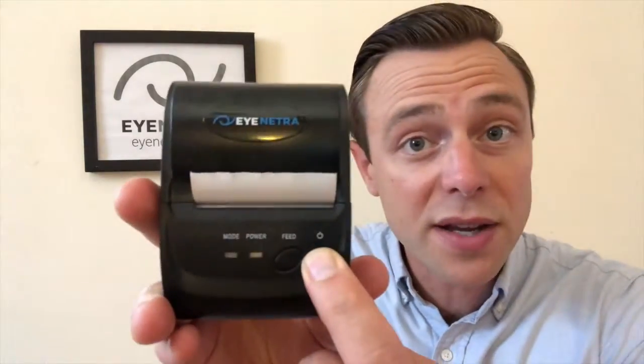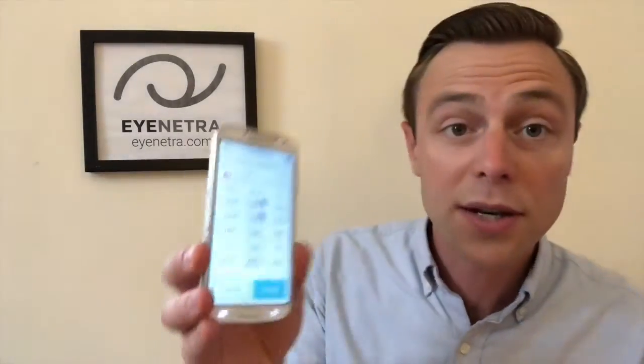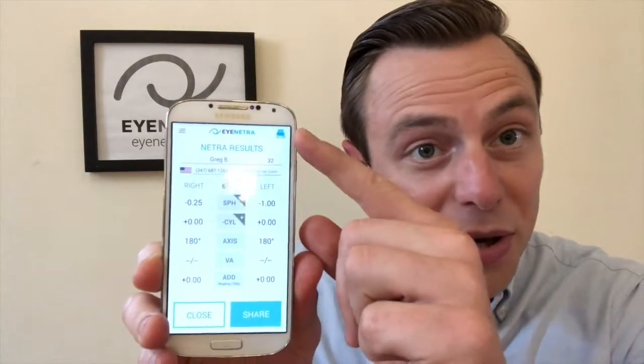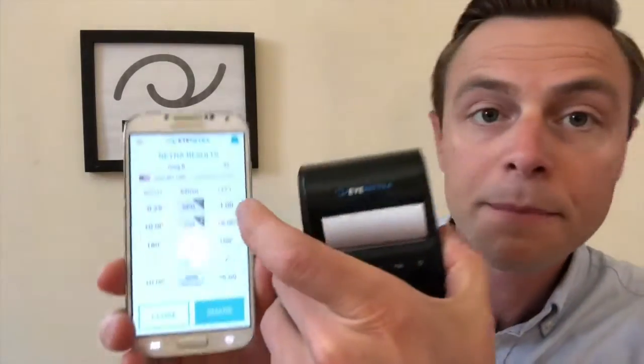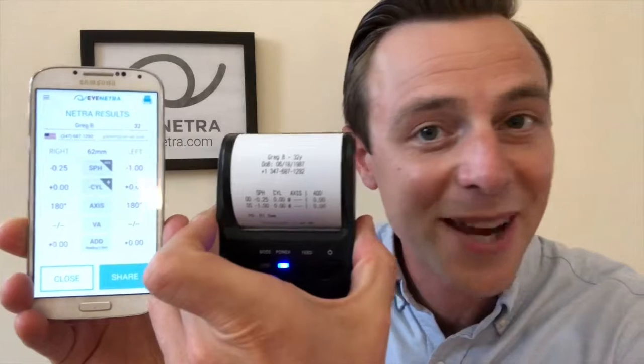You can quickly and easily print the results from either your autorefractor or your lensometer readings by using the iNetra Bluetooth printer. To start, press and hold the power button for a few seconds to turn the printer on. The blue light will illuminate when the printer is turned on. Then simply open up a reading in your phone by selecting the drop-down menu, select readings, select a reading, and then you'll see a blue printer icon appear in the upper right-hand corner. To print, simply tap the icon. That easy.